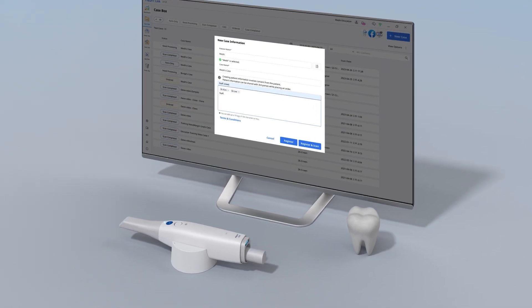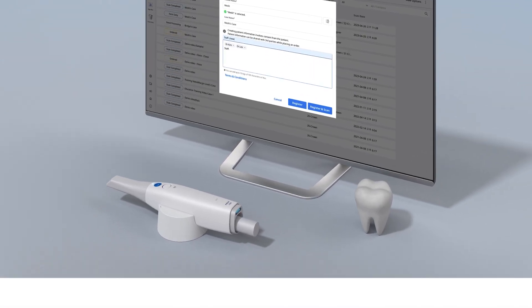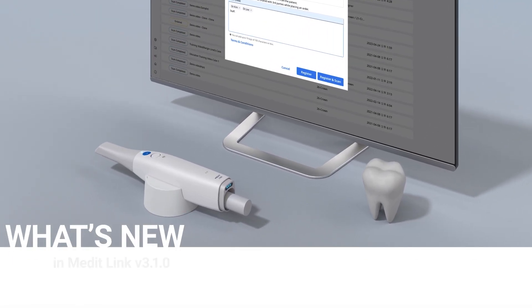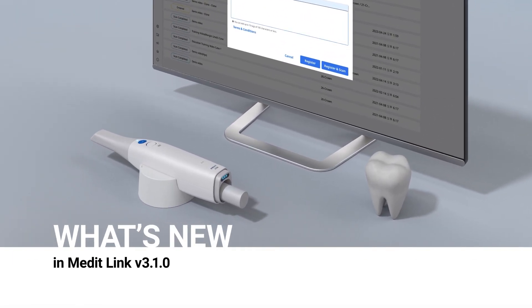This was a brief overview of what's new in MeditLink version 3.1. Update your MeditLink now and see the release notes for more details.